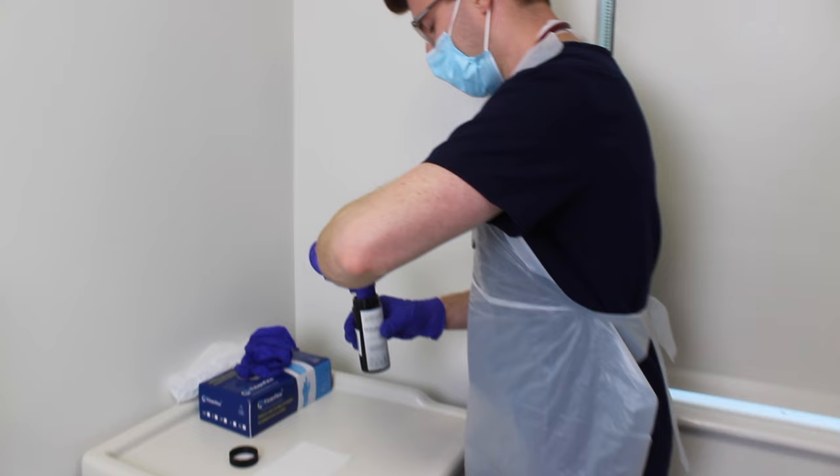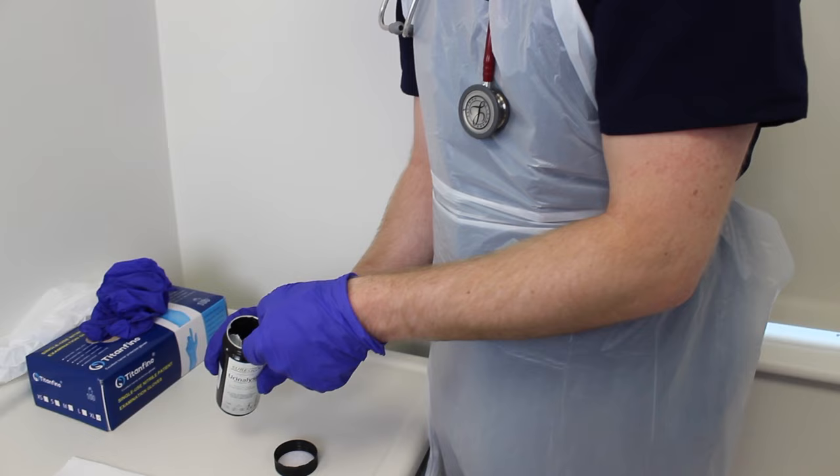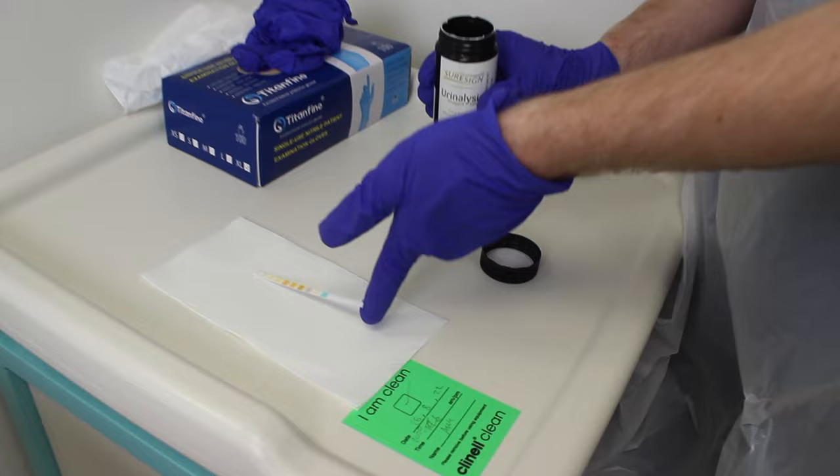Remove the dipstick from the container, taking care not to touch any of the reagent squares. Set the dipstick down on a piece of clean tissue and replace the lid of the container to prevent the dipsticks from oxidizing.